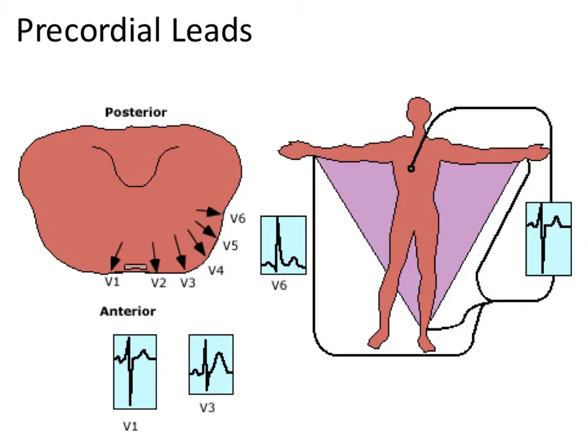So you can think of having the negative charge somewhere in the patient's back, and then you can put leads called V1 through V6 going around the heart, and I'll show you a picture in a little bit. That will give you electrical vectors going all around the heart, and be able to look at the electrical voltage from different directions.